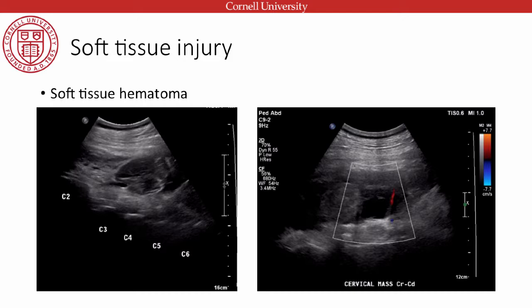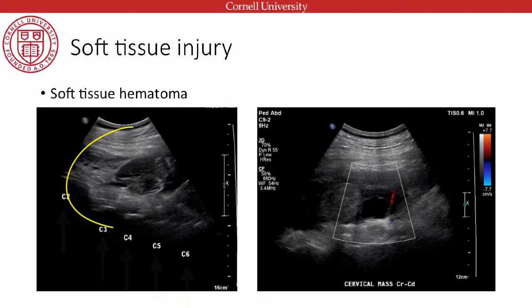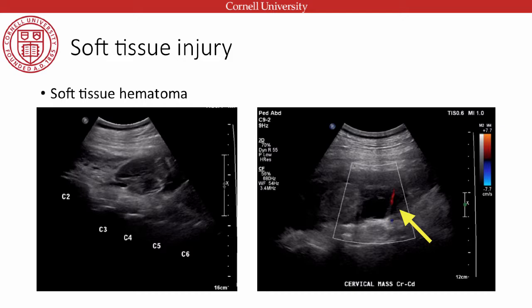Here's a hematoma I saw this week — an ultrasound of a dog's neck. C2 is here, with the dorsal laminae of C3 through C6, and soft tissues including nuchal ligaments dorsal to the spine. There's a mass lesion here — a hematoma in the neck. Hematomas tend to be hypoechoic with septa forming over time, becoming more echogenic as they contract. This one had blood vessels coursing through it, indicating the blood had dissected around the vasculature. Generally they appear as a fluid-filled hypoechoic mass lesion in the soft tissues.